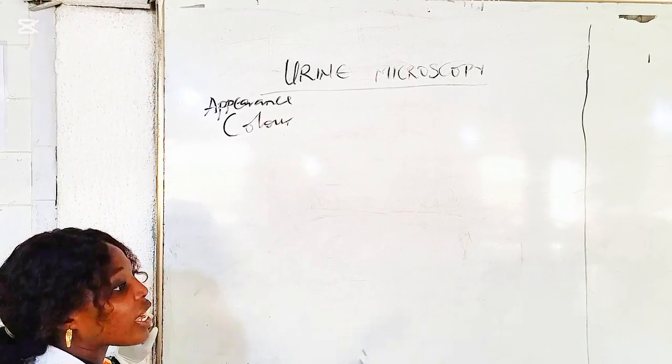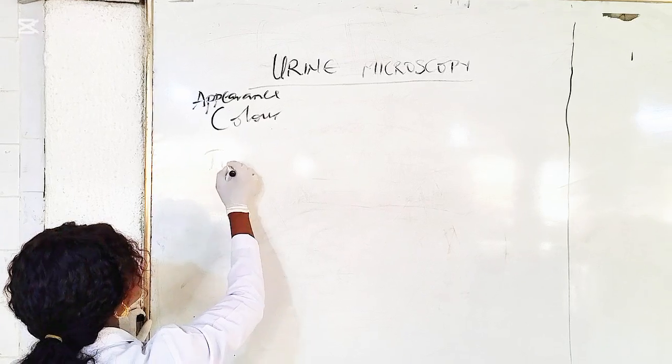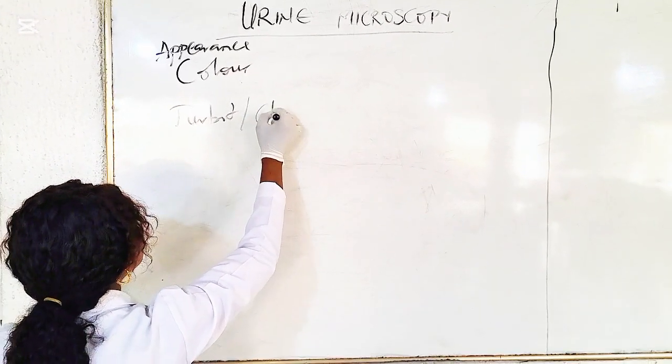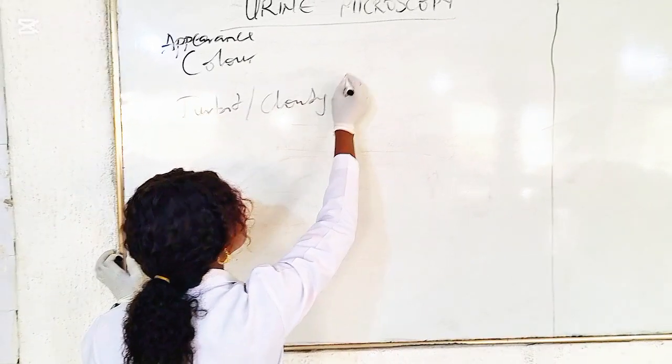You also check if the urine is turbid, or if it's cloudy, or if it's clear.